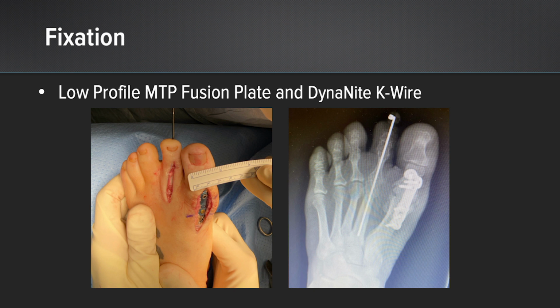Here you can see clinical and fluoroscopic imaging of the definitive fixation with a low-profile metatarsophalangeal joint plate and locking screws, which had purchased into the patient's native bone as well as our allograft dowel.